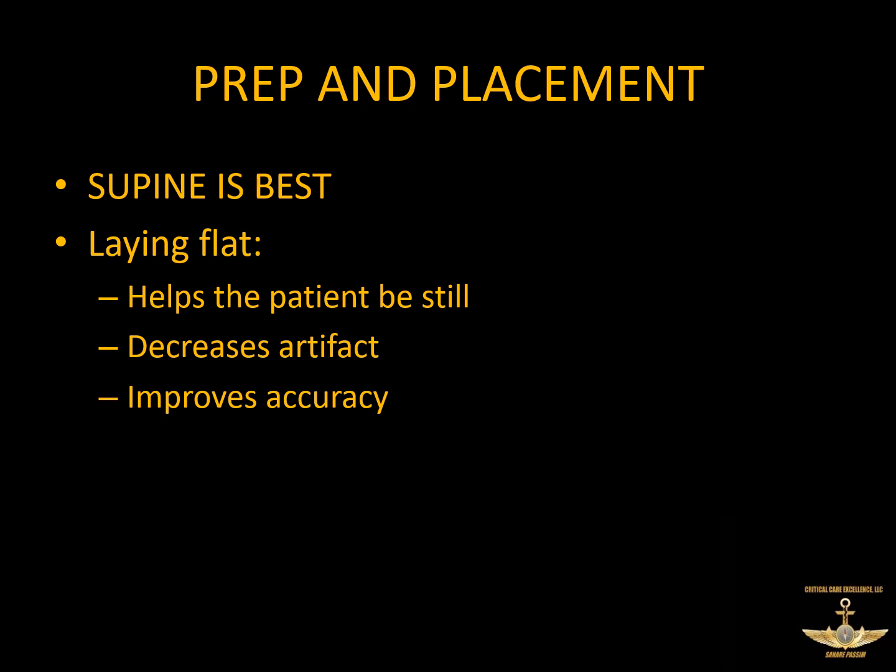So it's going to decrease the artifact, and artifact is just extra squiggles you get in the tracing from somebody moving around. And it's also going to improve your accuracy. If you can't get somebody laying flat, and usually you're not going to, somewhere in the neighborhood of 30 to 45 degrees head of bed up is perfectly fine. But the biggest thing there is you get them to lay still.